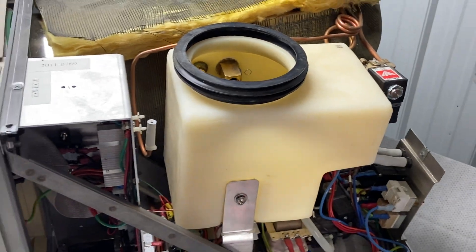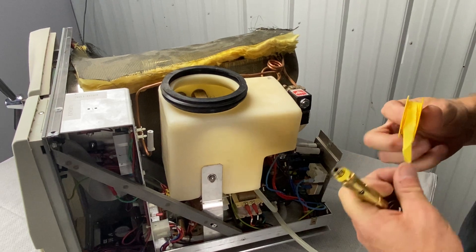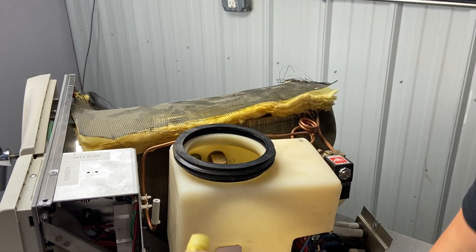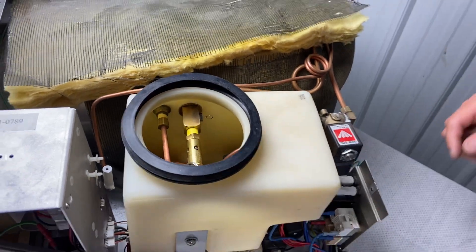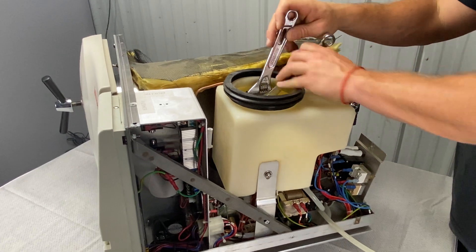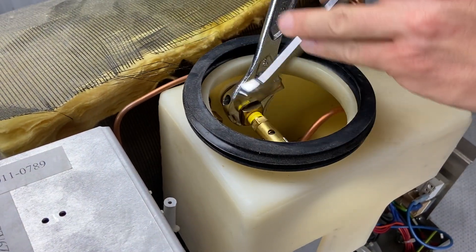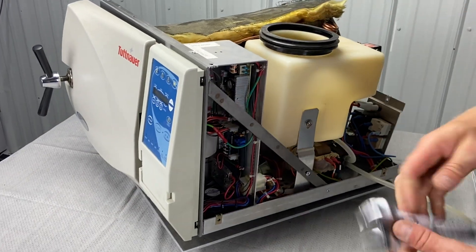Now we're going to do the safety valve. I do like to put Teflon tape on this one. I like to go counterclockwise, and I prefer the yellow tape — it's more durable. Get it tight, smooth it off, then start hand tight. Once hand tight, use the adjustable wrench on the block and tighten the safety valve. You don't have to get crazy with it — get it nice and snug. The reason we don't want to over-tighten is so we don't have trouble removing it next year.